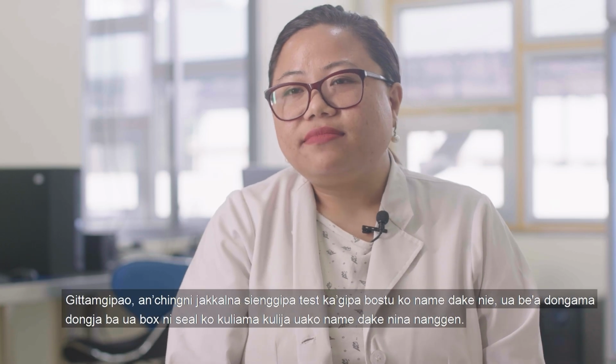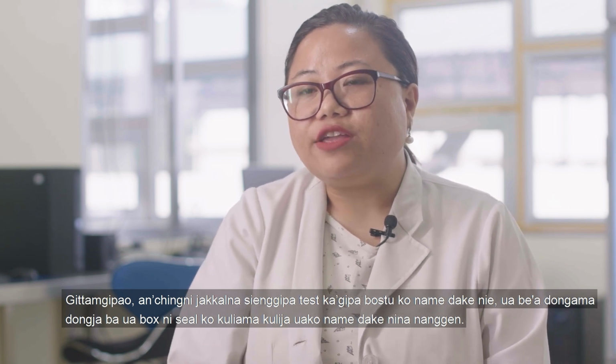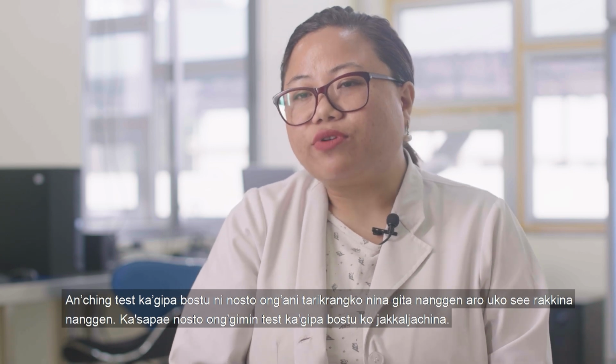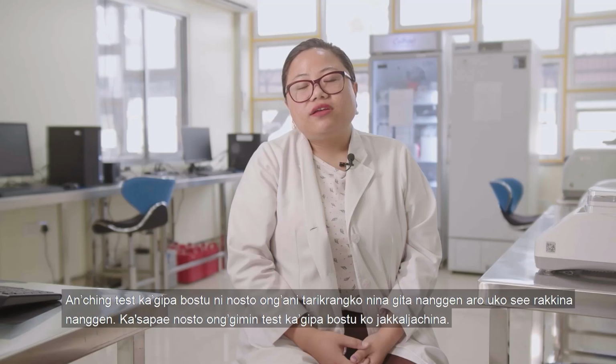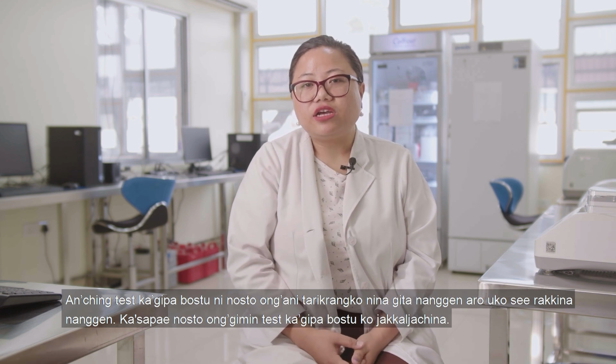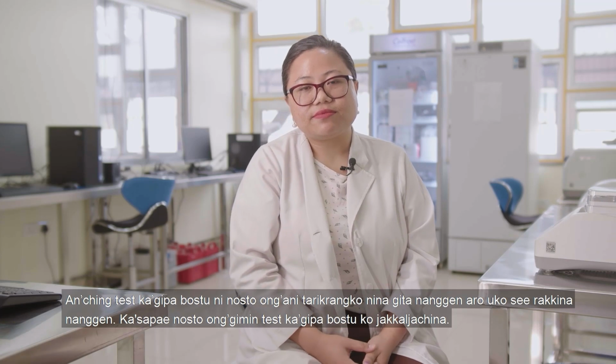The third step is you look at your test kit box that you're going to perform, and you look at the integrity of that box, if it's broken or the seal is broken if you have taken it out newly. You're going to look at expiry date and the lot number. Note it down. Please do not use any expired kits.